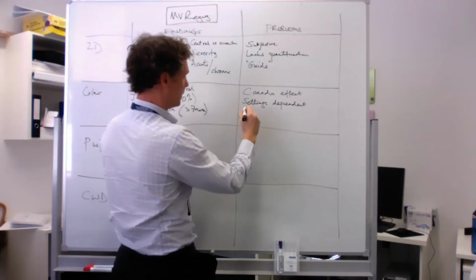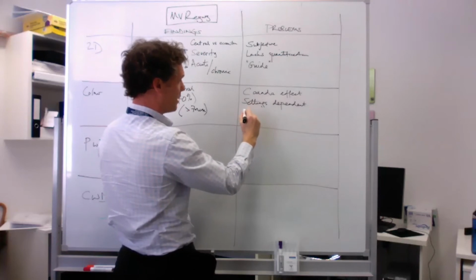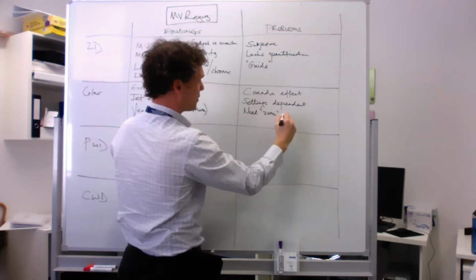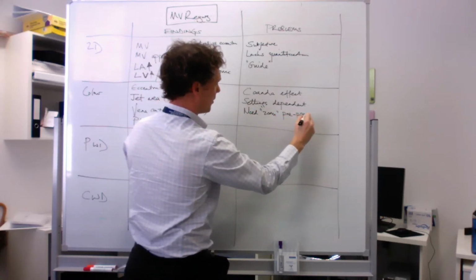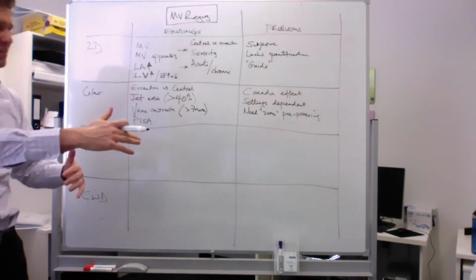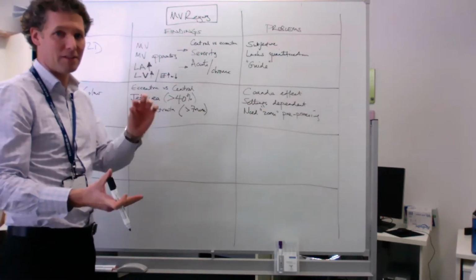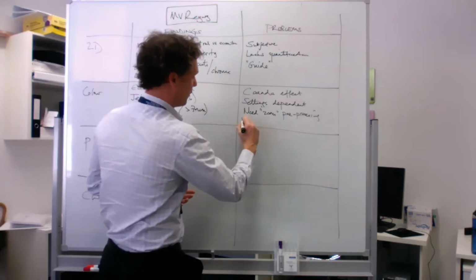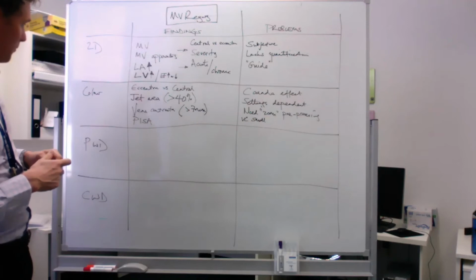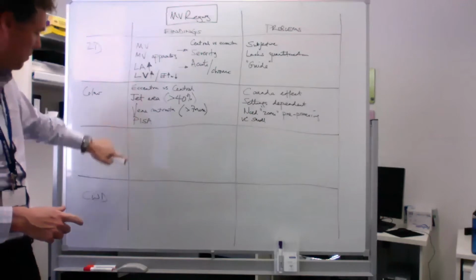Depending on your aliasing velocity that you set. Yeah, so absolutely. So that's all the settings. I'd say also you need zoom, pre-processing. And I'd say that 7 millimeters, you know, we say the curve goes from like 4 to 7, I think, being mild to moderate and severe. I think it's pretty hard to make millimeter measurements like that. So I'd say the VC is small. Nice. Why don't we bring in this a bit later?